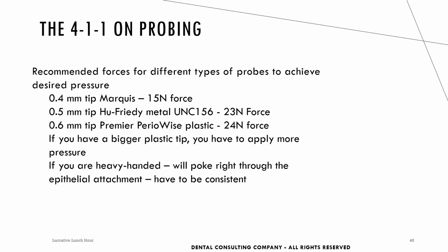It's important to know which probe you have at your practice and the amount of force that has to be applied when probing an implant. If you have a bigger plastic tip, you have to apply more pressure, whereas if you're heavy-handed, you could potentially poke right through the epithelial attachment, and you have to be consistent.